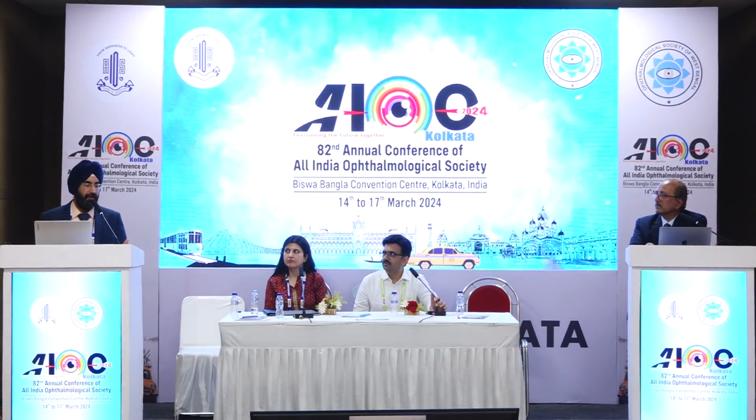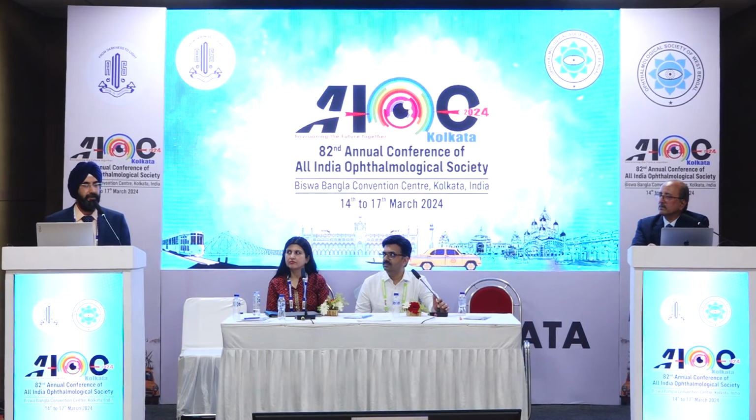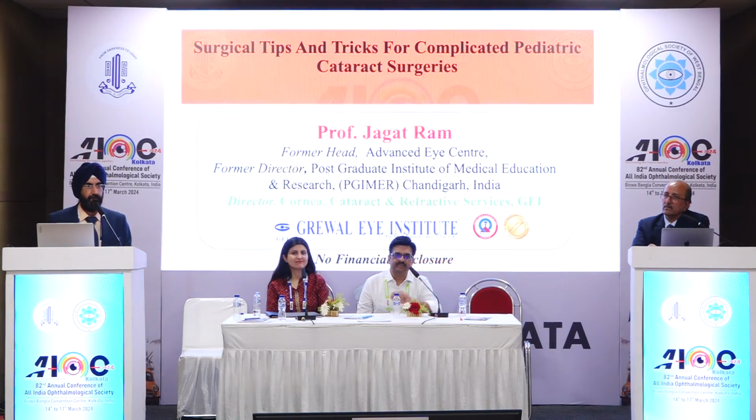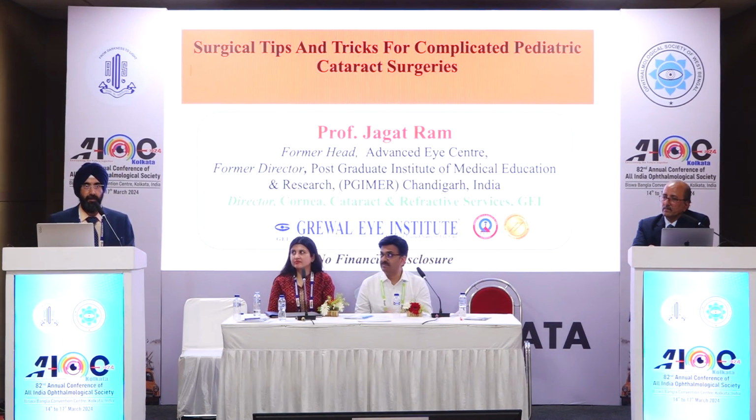And of course, probably a 3-piece IOL is the best thing. I still use the 3-piece IOL because I'm comfortable with it and it feels safer. And if you're not very confident, you can do it after IOL implantation with a high-speed cutter; nowadays it's very easy. Again, the size of the rhexis has to be bigger as compared to what you conventionally would use for in-the-bag implantation.